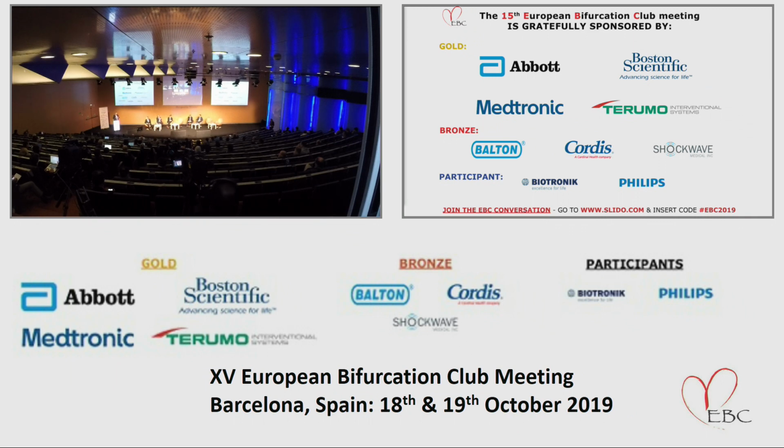Well, actually, it was one of the things that was quite amazing. I think the 13 peaks actually makes the foreshortening less. Maybe you could see it quite easily on the stent boost, because normally you would expect quite a lot of foreshortening. And you saw the simulation, right? So with 3.5 to 6.0, it did foreshorten, but not much. It's essentially very minor. It's due to the design, which makes it shorten very little, even if you go from 3.5 to 6.